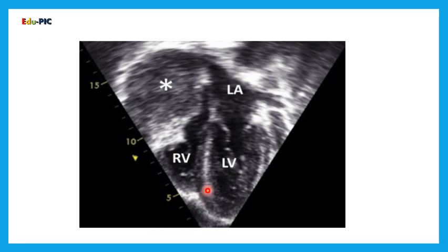Here we have another example with a patient with a cardiac tamponade, but he has a big thrombus compressing the right atrium. We cannot really see the right atrium properly in this image, which has been compressed by this thrombus, which can cause the cardiac tamponade, and this patient needs pericardiocentesis or intervention as soon as possible.